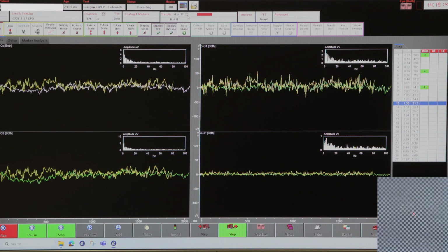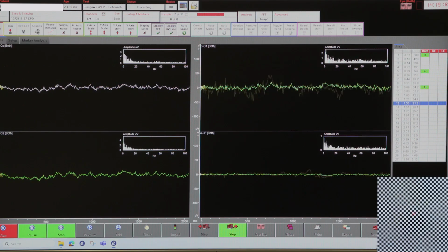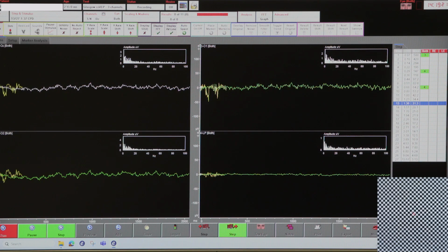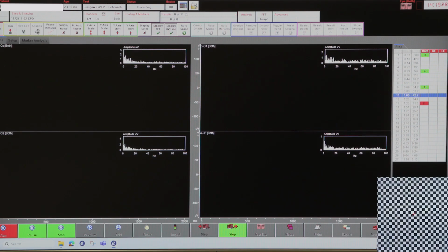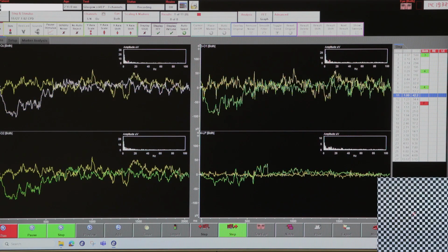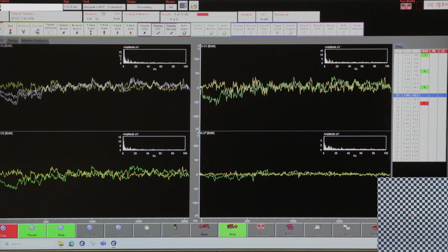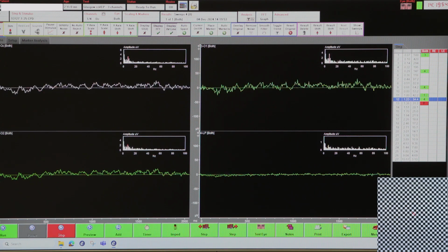We're performing 2 different analyses on each channel. Firstly, seeking a critical signal to noise ratio, and secondly, undertaking circular t-squared tests which look for vector clusters which exclude the origin. No VEP was detected there, so it's 2 steps back up the staircase. Remember, we're seeking green, green, red for consecutive check sizes getting smaller. That's now achieved, so the test is finished. That one took just 90 seconds total recording time because not too many check sizes were needed.